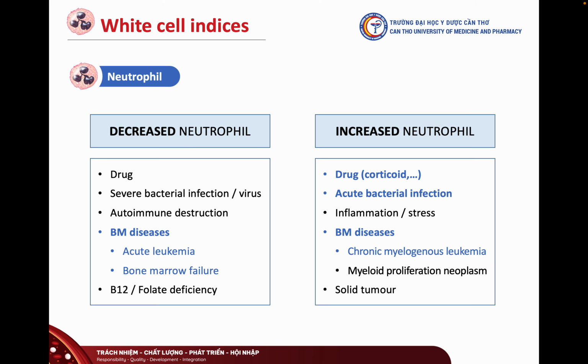In short, always think about the context. Is it an infection, a drug effect, or something deeper like a bone marrow problem? And remember to pay close attention to the highlighted causes here. They are very common, clinically relevant, and often show up in real-world cases.